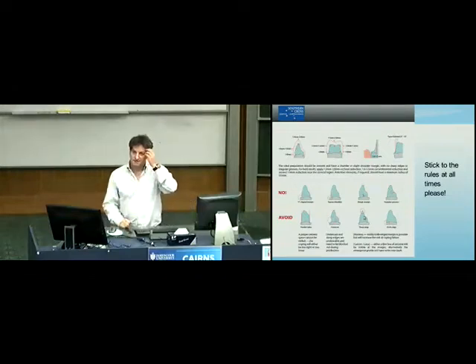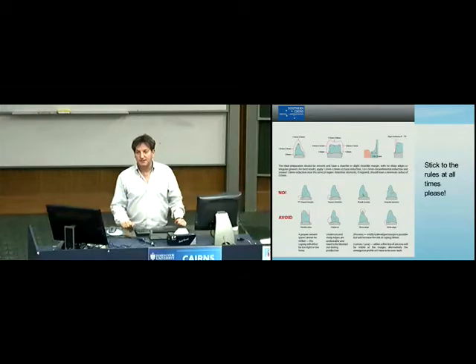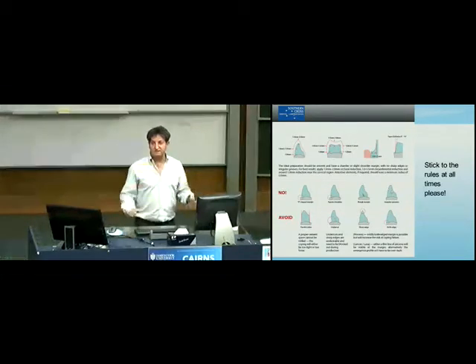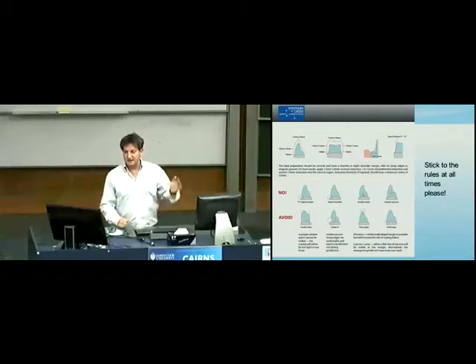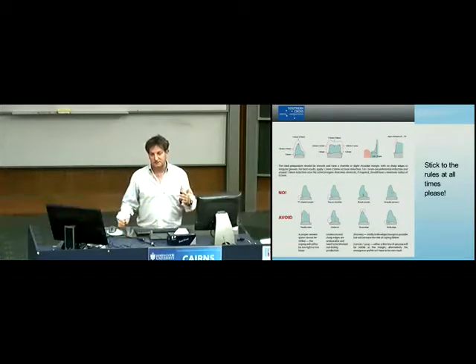Edge, the sharp edge on the incisor. I still see this time and time and time again. Please, if you can, just get out a Softlex disc, get out a silicone wheel, whatever you do, please round off those angles. Anything sharp with ceramics spells trouble. Anything thin with ceramics spells trouble.